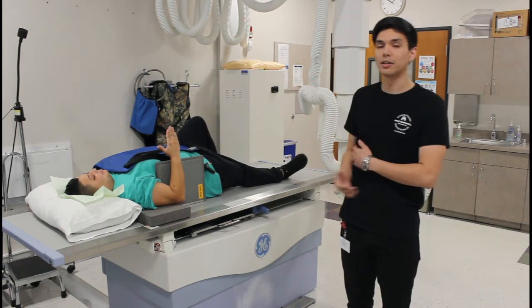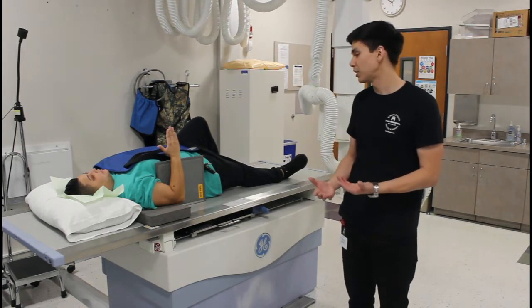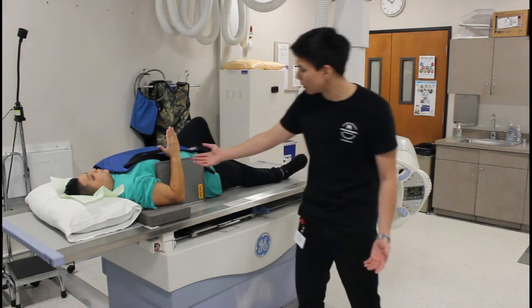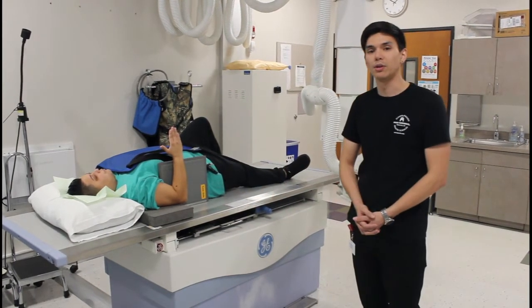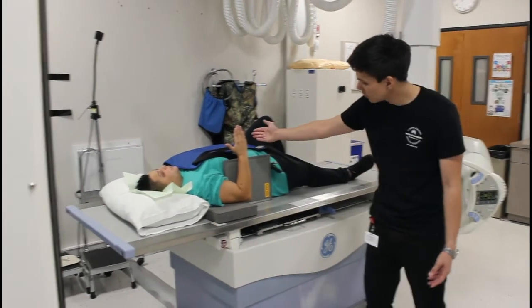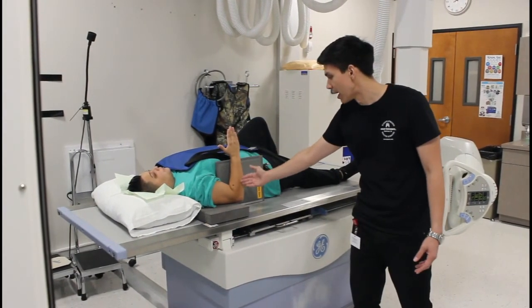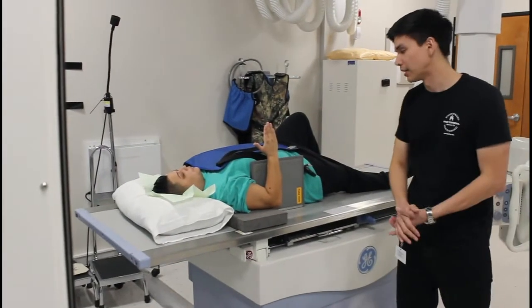So the patient will already come in on a gurney or in a laying down position, and you'll see that they won't be able to extend their arm as previously mentioned. So again, going ahead with the radial head method, the patient is in a supine position. The arm is going to be making a 90-degree angle to the body, pointing superiorly.